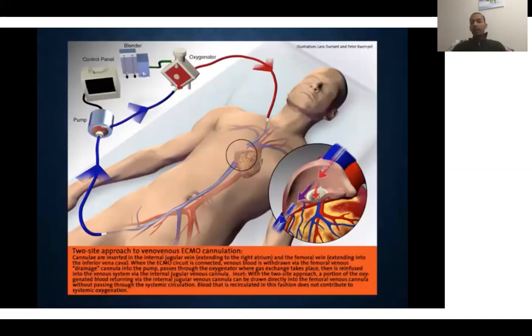And there is a problem in this cannula because what happens is oxygenated blood comes back down the SVC and there is some amount of fresh oxygenated blood, as you see here, just because the jet is being directed like this. Some of the oxygenated blood gets pulled into the IVC and actually gets pulled into the access cannula.